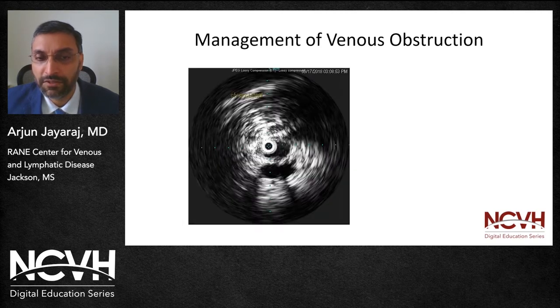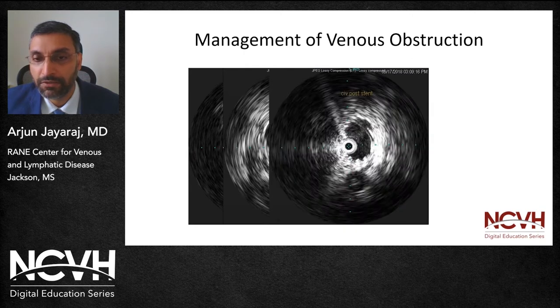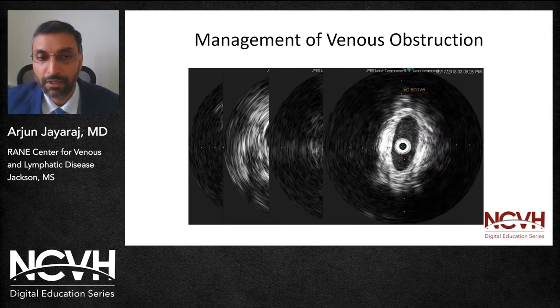We performed IVUS interrogation with every one of our deep venous procedures. In this particular patient, this is the common femoral vein below the stent, the stented external iliac vein which is widely patent, as is the common iliac vein that was stented, and this is the IVC above the stent. She's approximately a year out now doing very well.